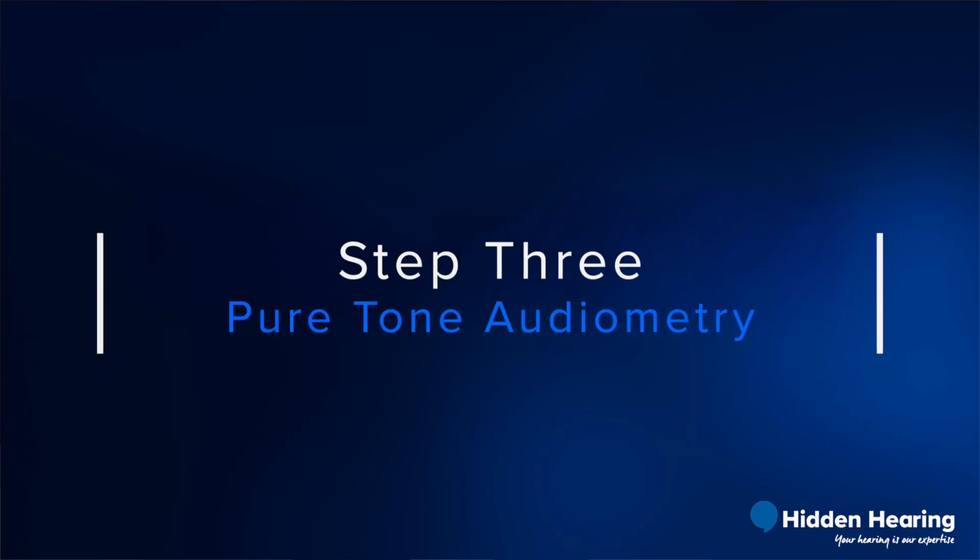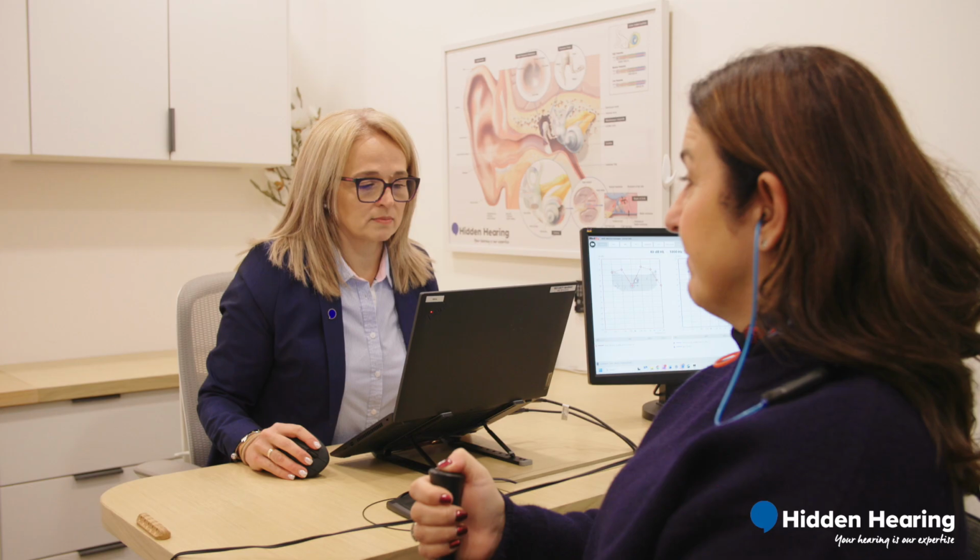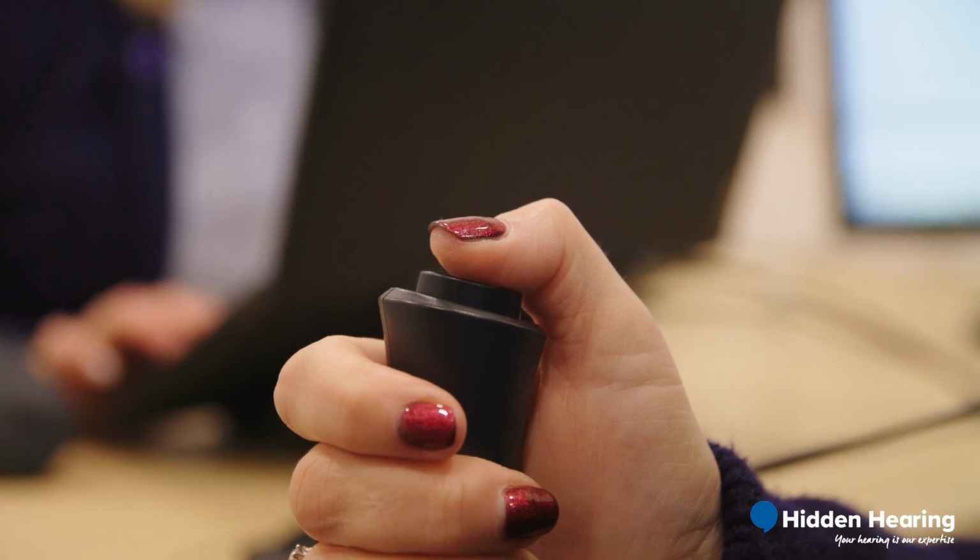Step 3, pure tone audiometry. What that involves is us blocking the patient's ears by little inserts and giving them a button so they can respond to the little beeps we're going to play in their ears during the test. For patients with tinnitus, we play a different tone than just a steady beep. We need to establish what are the faintest sounds they can hear.